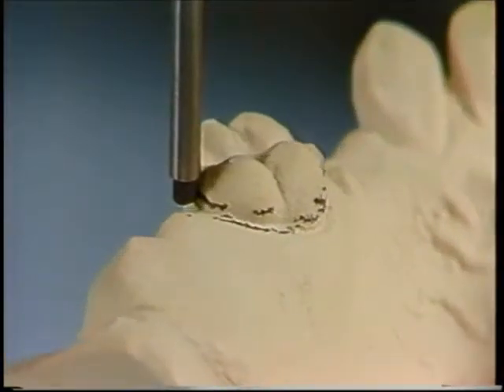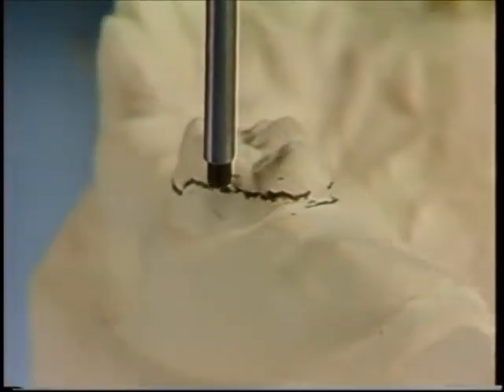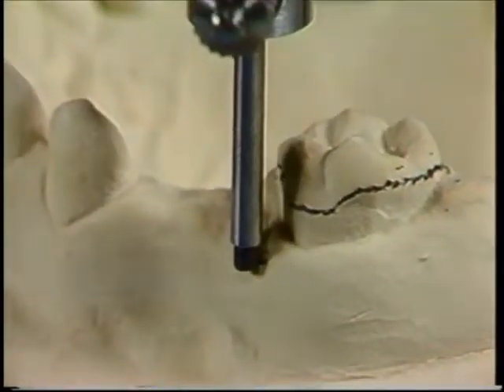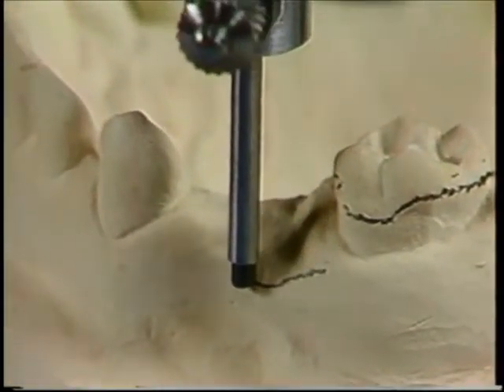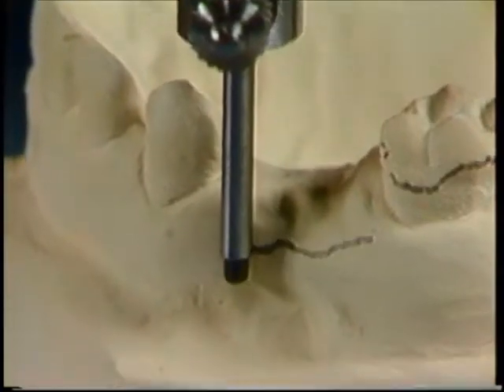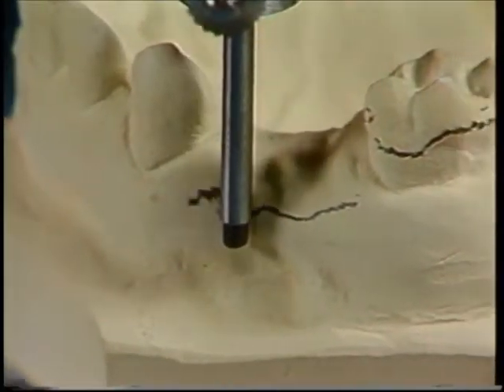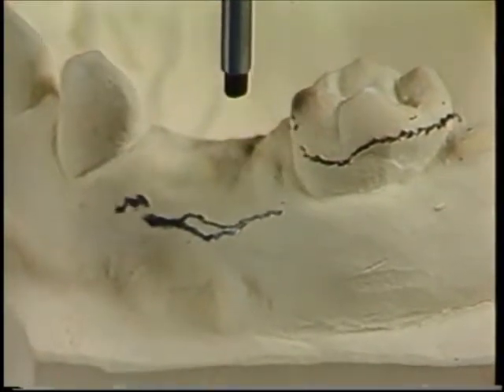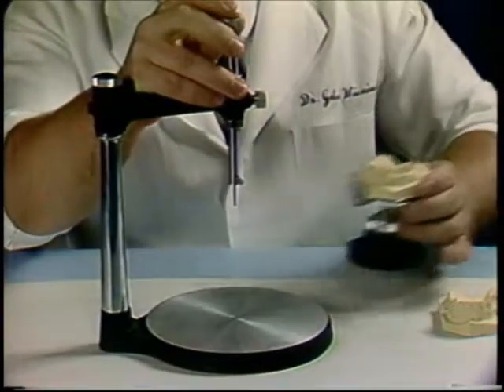Ideally, the survey line is found in about the middle 1/3 of the tooth. Now the marker is being used to mark the height of contour of a buccal exostosis. Each abutment is marked in turn.